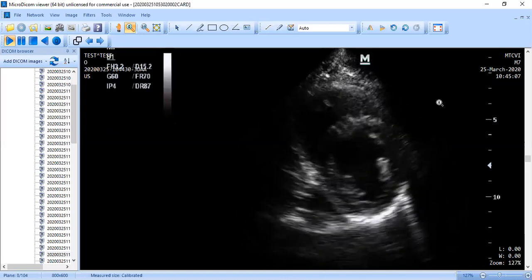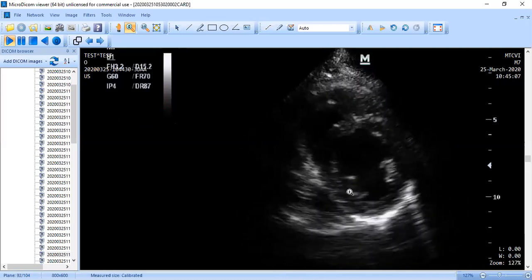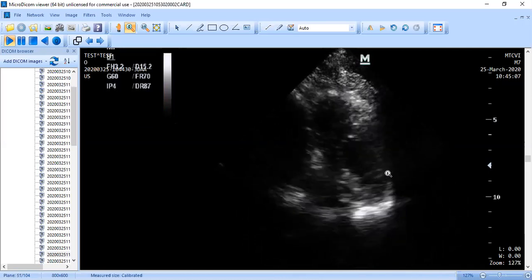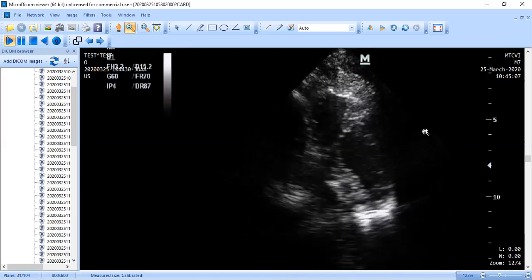All right, now down to our papillary muscles. I want to see the anterolateral and the posteromedial papillary muscle here. Okay, nice round ventricle, and then on down to the apex. As all of you have kind of demonstrated, sometimes we have to move down a rib space or 2 to find the best apex shot of the heart.